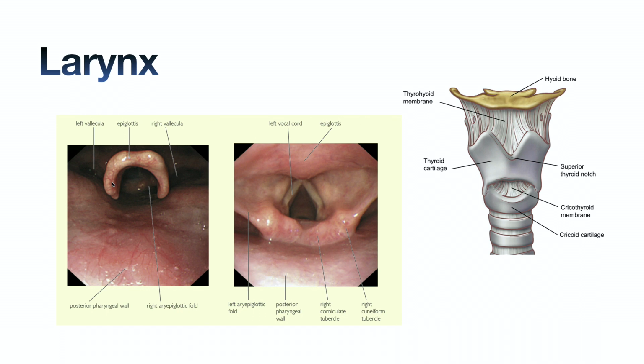a retroflexed epiglottis, a prolapsed epiglottis due to glossoptosis. We can also observe if there's any laryngomalacia, any vocal cord palsy, any laryngeal cleft, or other mass lesion. From time to time, we may also have a glimpse of the subglottis through the vocal cords, but sometimes it is difficult in a small baby.